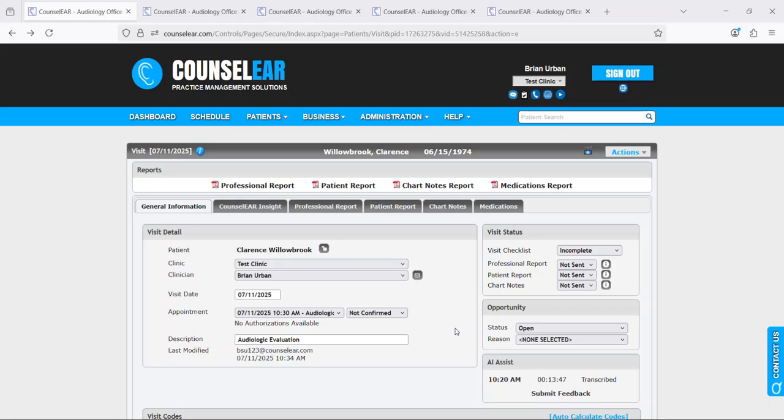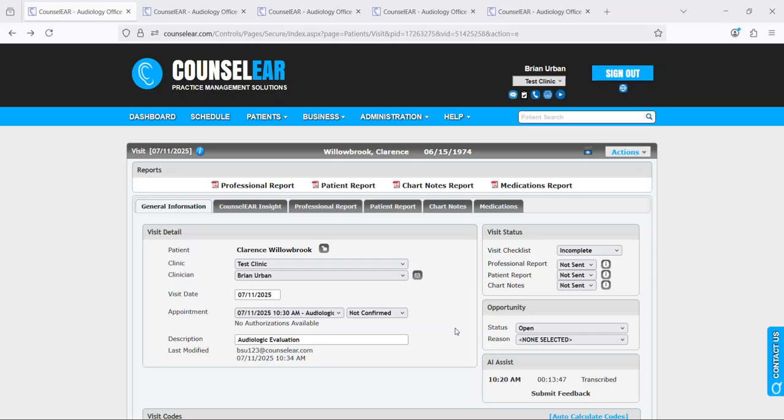Now Counselor AI Assist is designed to listen to conversations with you, your patient, their caregivers, their family and then turn that conversation very quickly into a transcript which can then be used immediately to generate text for your professional report and your chart notes.